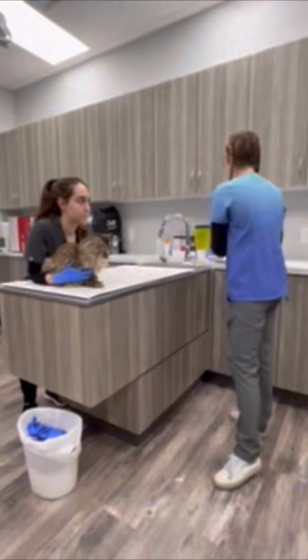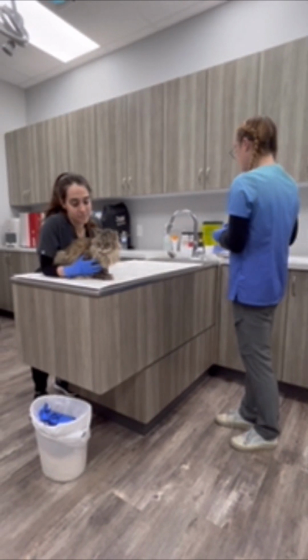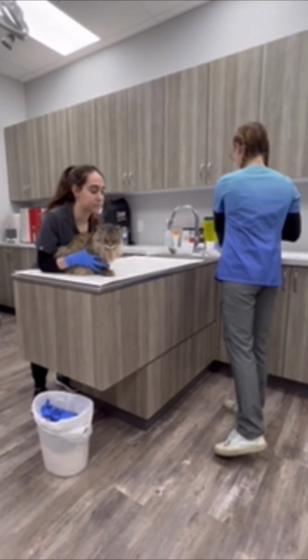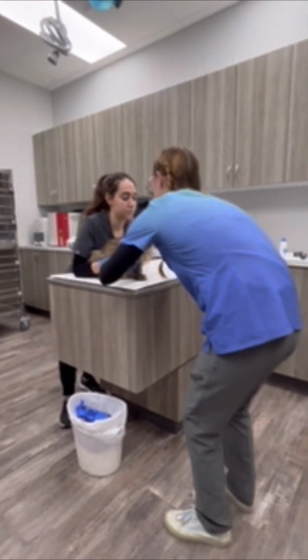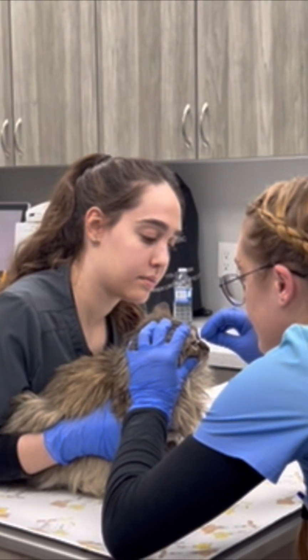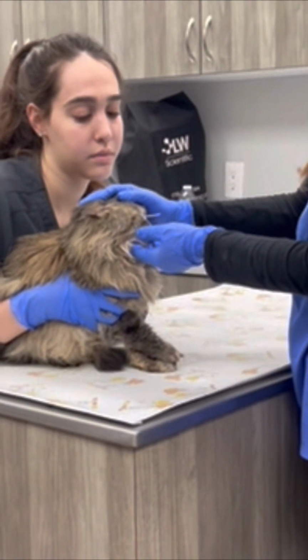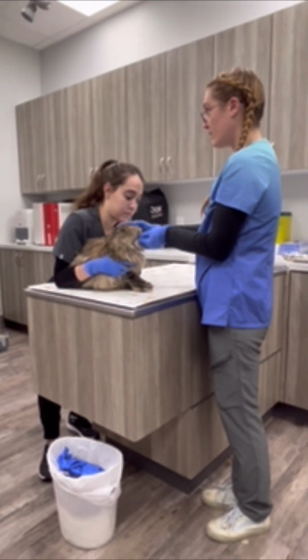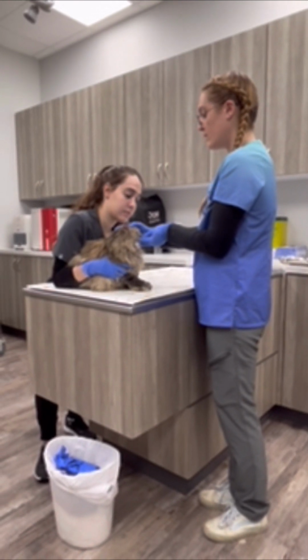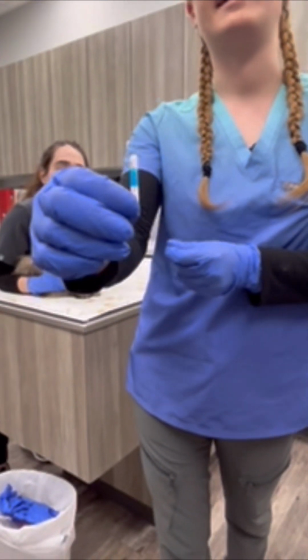I'll now be repeating this process on the right eye. And the test strip is being placed in the lower eyelid of the patient. 1 minute has passed, and this test strip is at 16, which also indicates normal tear production.